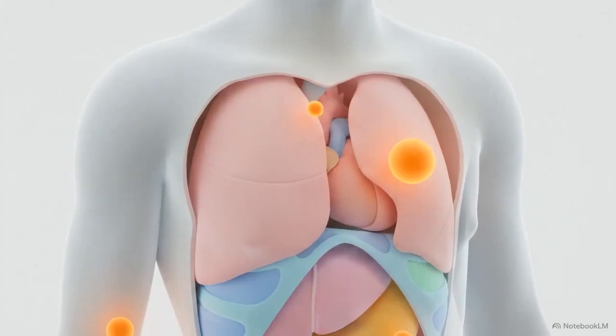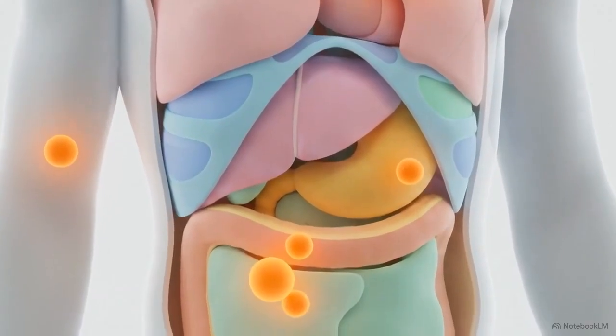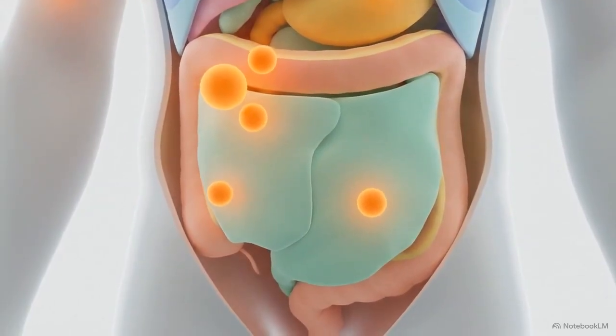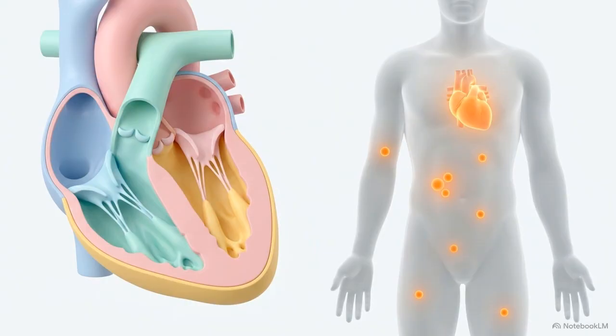However, the whole-body scan provides a secondary benefit by mapping systemic involvement. In this patient cohort, whole-body PET-CT identified clinically silent peripheral emboli in 15% of cases. Finding these distal infections provides additional confirmation of the cardiac diagnosis. While clinicians must account for temporal and surgical artifacts, the whole-body scan offers a comprehensive map of both the primary infection and any embolic spread.